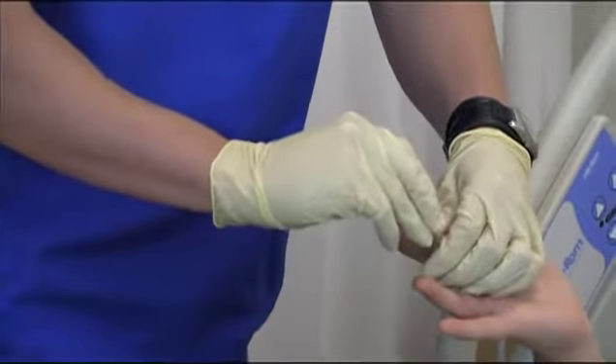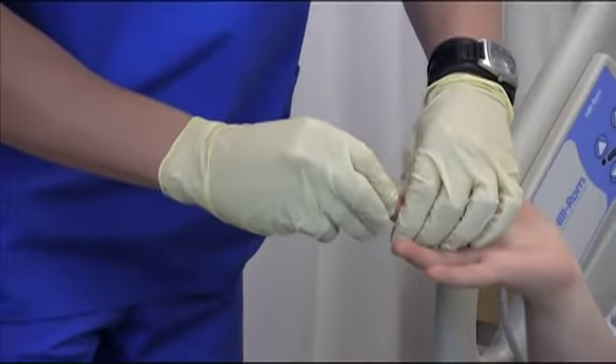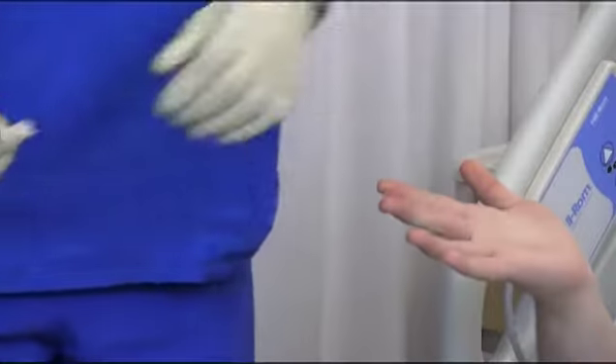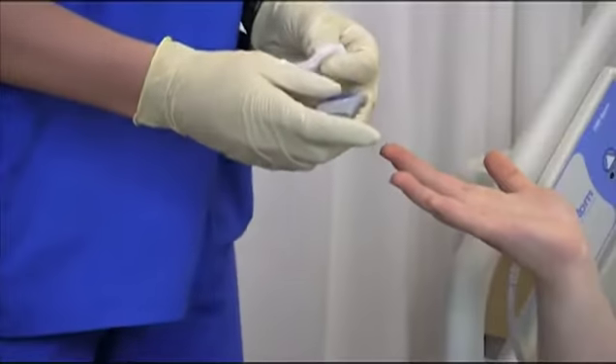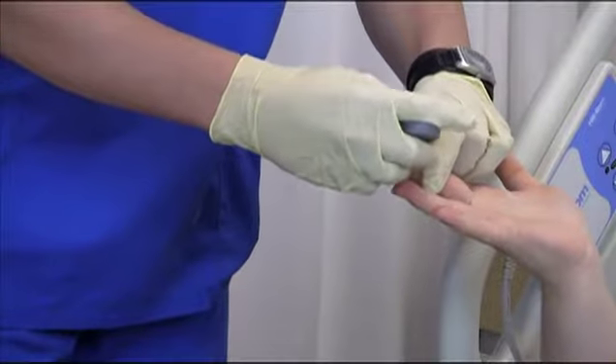Prepare the site for finger stick. Assemble the finger lancing device. Prick the side of the fingertip using a lancet or automatic finger puncture device.